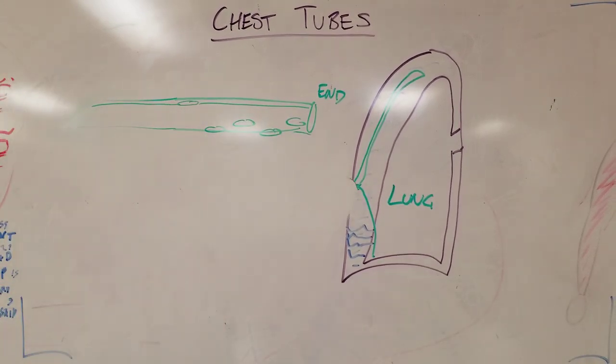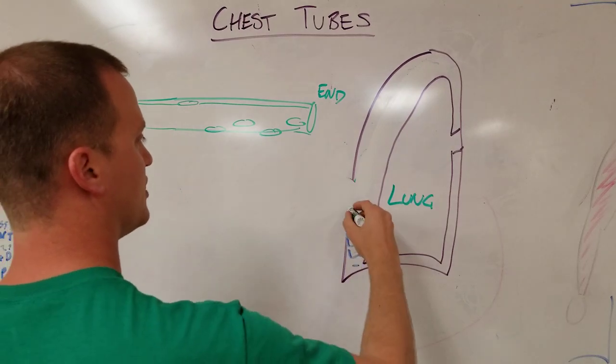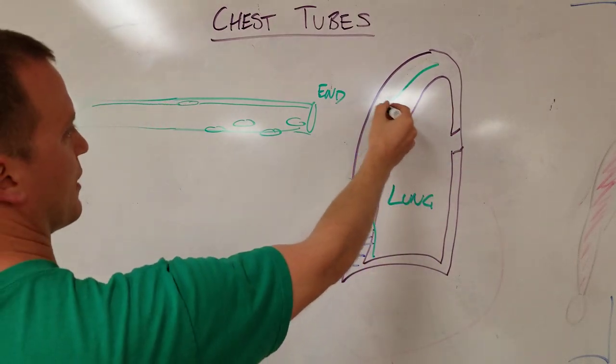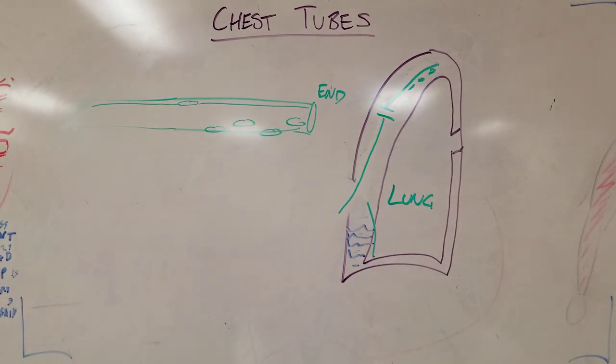So on a chest x-ray, you can't see this piece of plastic that well, however, when you look at the patient's chest x-ray, you'll see this nice white radiopaque line that stops and then takes off again. And so you know that, hey, that's my first hole, and then I know that I have more holes here, even if I can't see them on chest x-ray, so you know what part of the pleural cavity you're accessing with that tube.